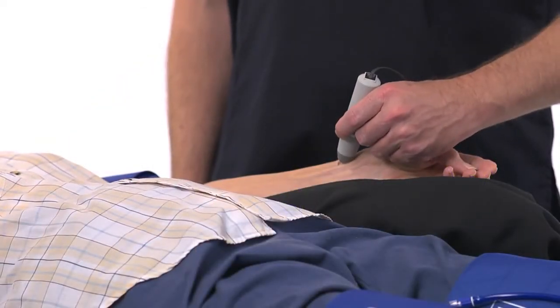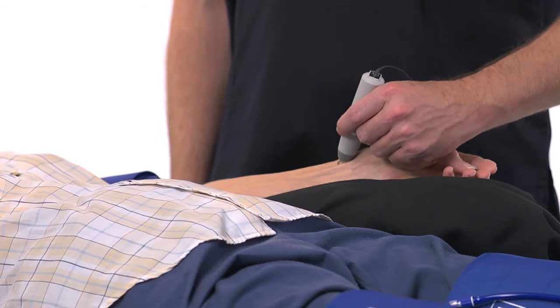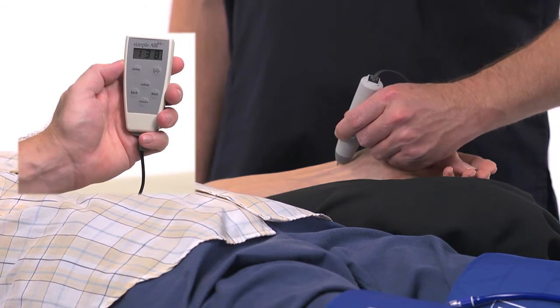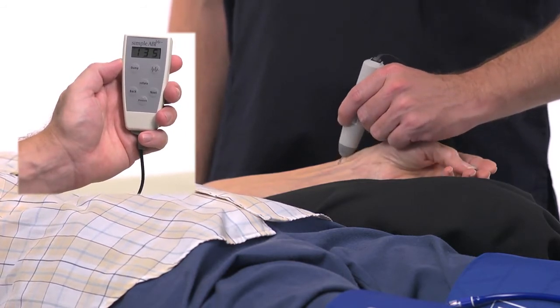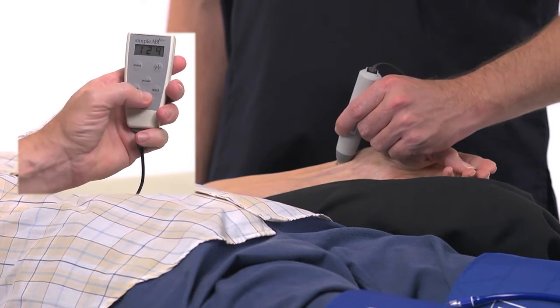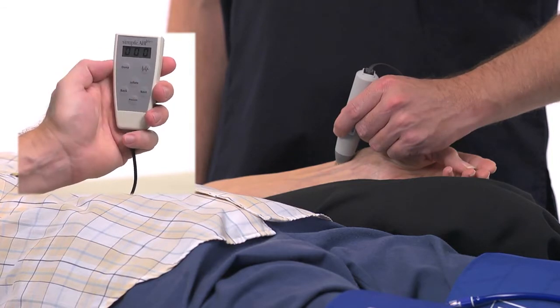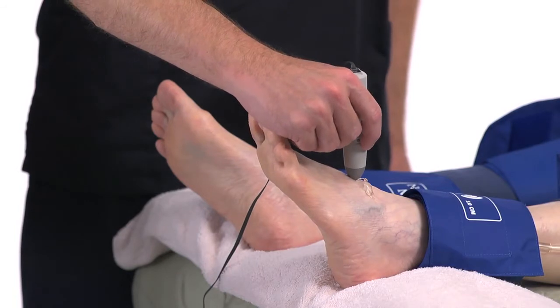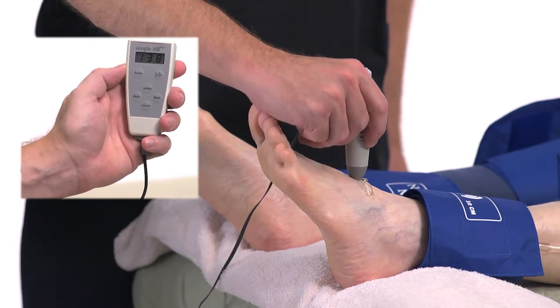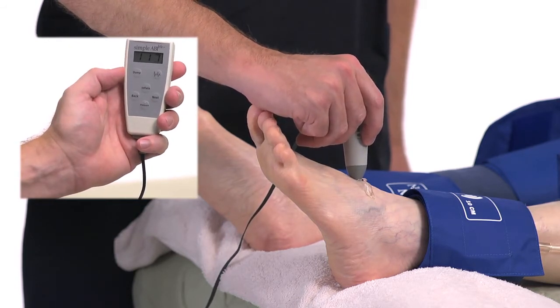Repeat the sequence you just completed on the right side of the patient for their left side. Find a good Doppler signal at the left radial or brachial artery. Press and hold Inflate on the CuffLink remote until you no longer hear the Doppler signal and continue for an additional 20 millimeters. Release the Inflate button and the cuff will automatically start to slowly deflate. When you hear the Doppler signal return, press the Pressure button and it will be entered in the left brachial field. Press Next to move to the left DP field. At the left DP, find a good Doppler signal. Press and hold Inflate until blood flow is occluded. Release the Inflate button to begin deflation and press Pressure when blood flow returns. The left DP pressure will be entered in the left DP field.